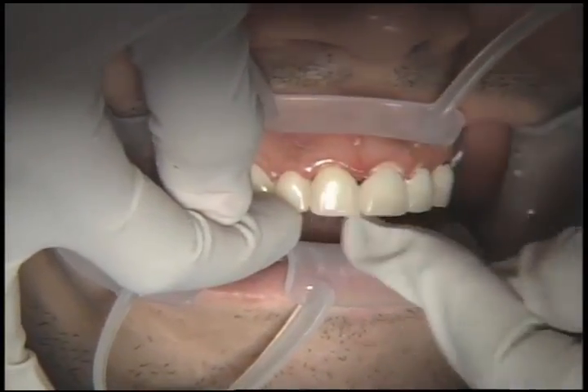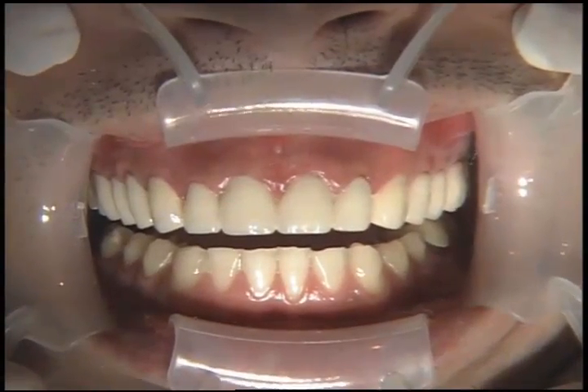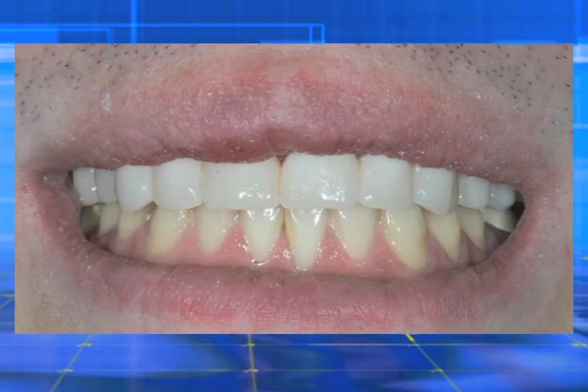We try the biotemps back on the anterior segment. Now that it's seating passively, we can go ahead and re-reline these so that they fit over the preps now that the post and cores are in place on teeth number 7, 8, 9, and 10. And if you remember what he looked like before, you can see just with the biotemps on we have a really great result. The patient was very happy at the end of this appointment, as he was at the end of the last appointment.